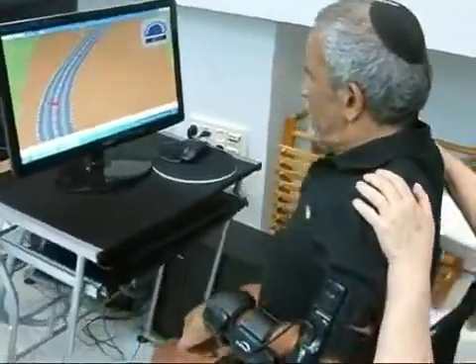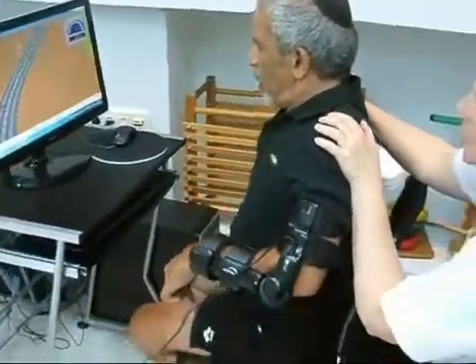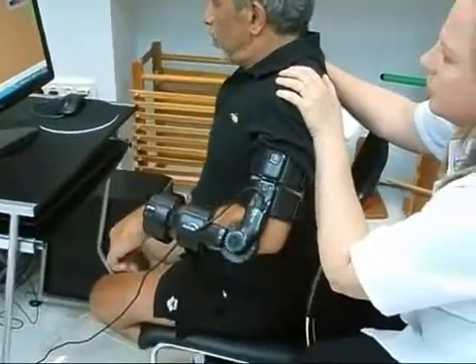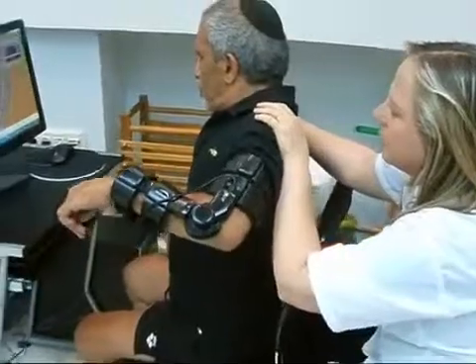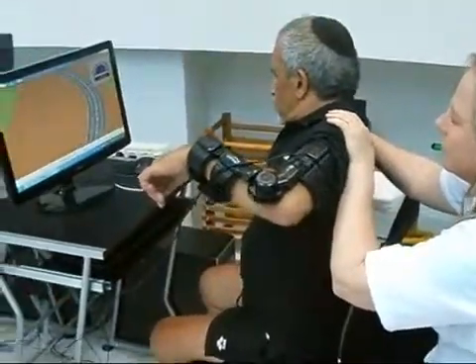The Arm Tutor system provides objective and quantitative evaluations and follow-up on the patient's treatment progress. The Arm Tutor has full FDA and CE certification. For more information, please visit the Meditouch website.